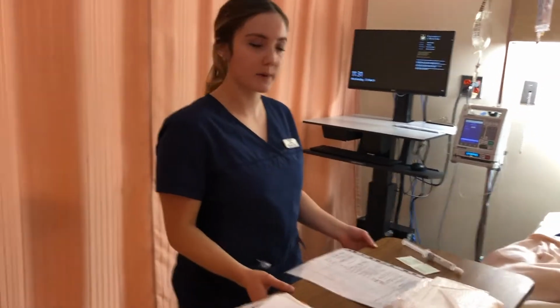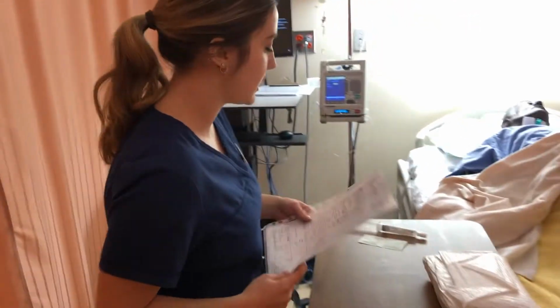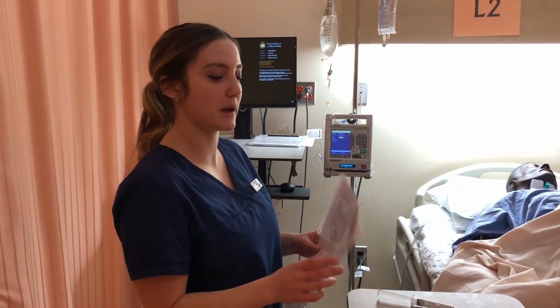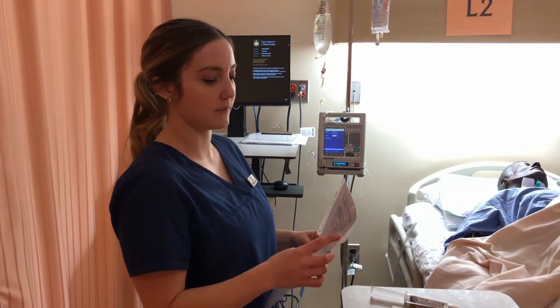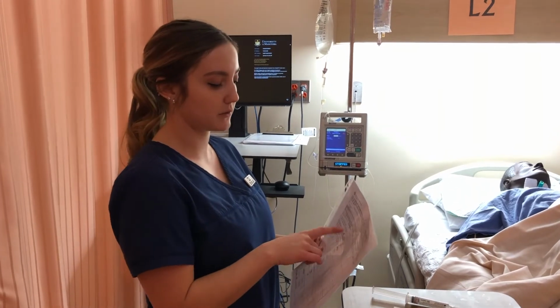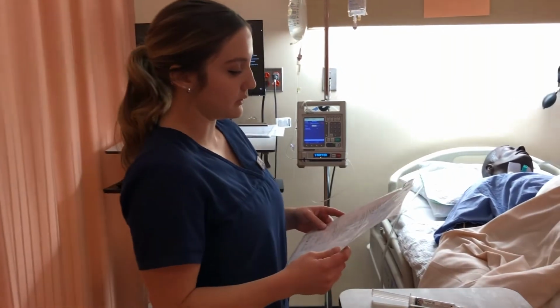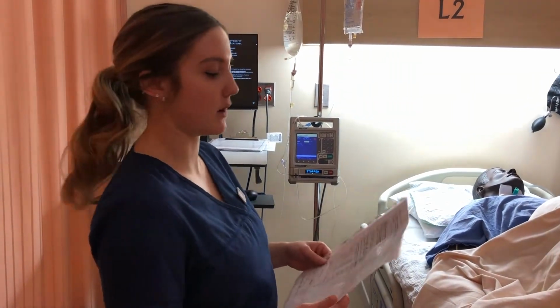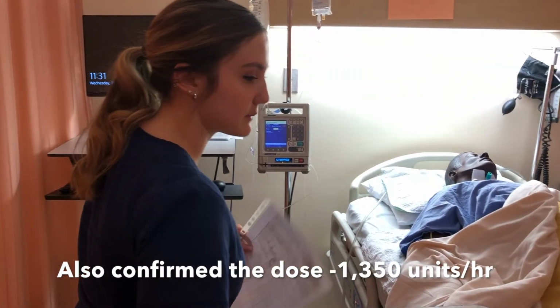It was already prepared for me, but I'm just going to do a first check here. So I've already checked my MAR and my doctor's orders together to make sure that my patient matches. My patient, their birthday, the medication, which is heparin, the route, which is IV continuous, the date, the time, the frequency, all match. So now I'm going to go into my patient's room.